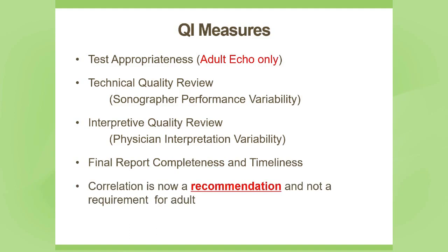For adult, correlation is a recommendation. Doesn't mean you shouldn't do it. It's still really great and it gives you lots of opportunities for improvement, but we do not require correlation anymore for adult echo. However, pediatrics, we still require it.